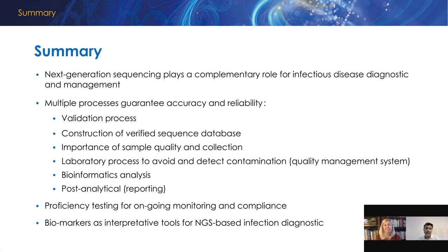That's a great question. One of the limitations that we have right now with CPT codes and NGS is that there is no direct generic CPT code that can be used. Some NGS laboratory providers are working directly with CMS to try to get a specific CPT code for the platform, for the test that they perform. And this is one of the limitations that is right now affecting NGS implementation, especially from the perspective of an outpatient setting.